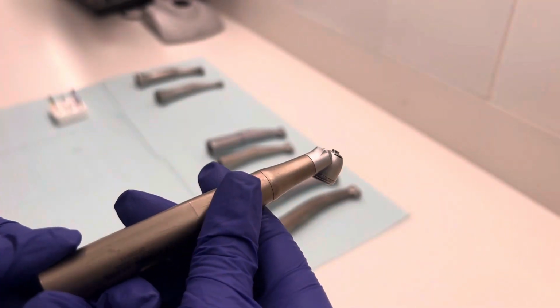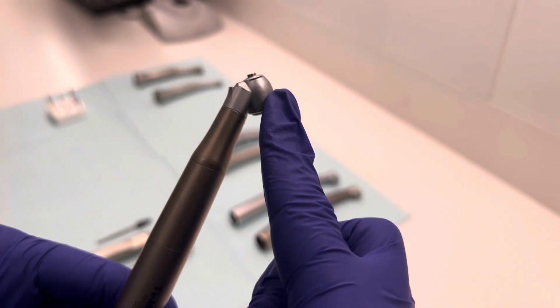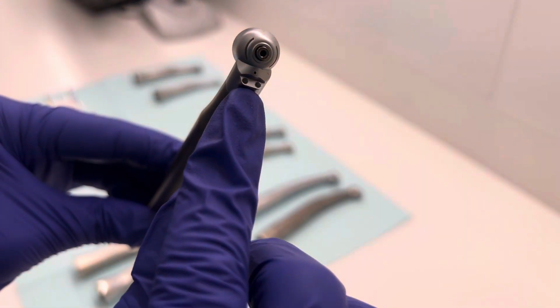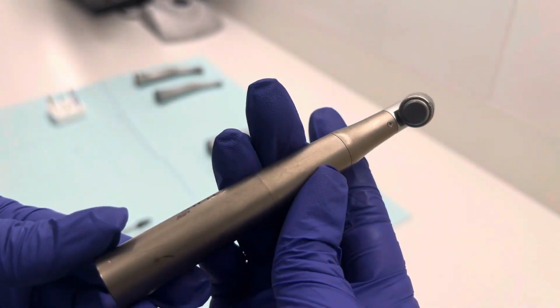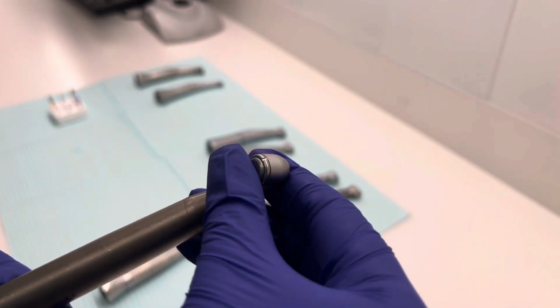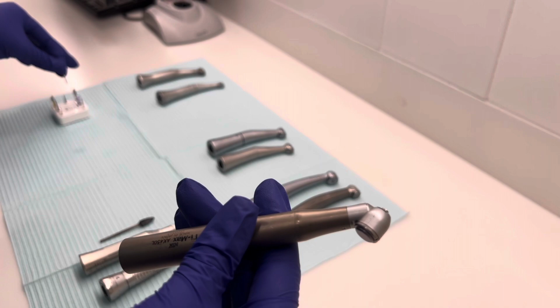Next, I'm going to be showing you a surgical handpiece and how to use a burr in it. It has a very similar shape to the high speed and is very easy to confuse the two. But as you can see, the head looks different, and everything else is basically the same in terms of how you use a burr in it.